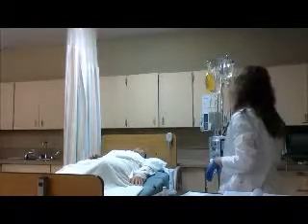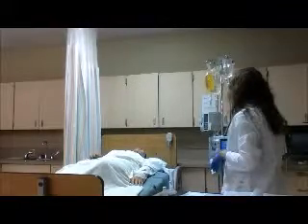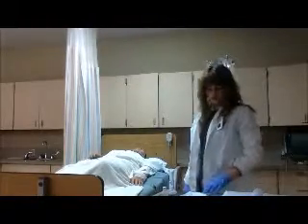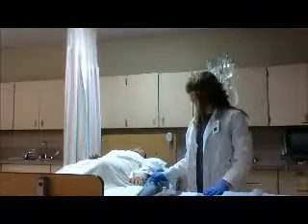I have a 500 milliliter bag, and as soon as this is done, this is going to take over running, or will be running at the same time. I can put the full volume into this, so I have a 500 milliliter bag, and then I can start. And with heparin, we're going to be monitoring the PTT coagulation, so that we can know how to titrate the dose to a patient. So I'm going to make sure that the site looks okay and feels okay, and that will be the end of my video.